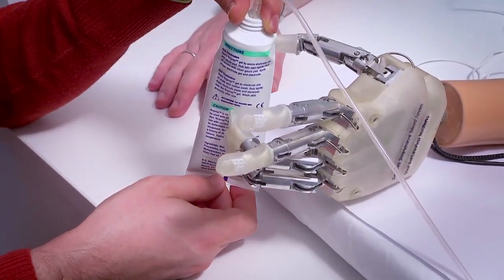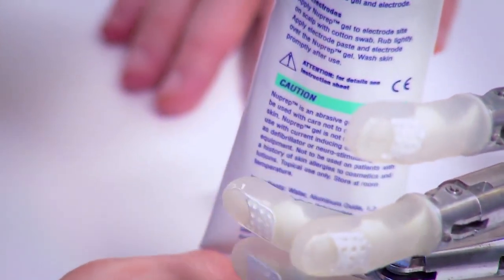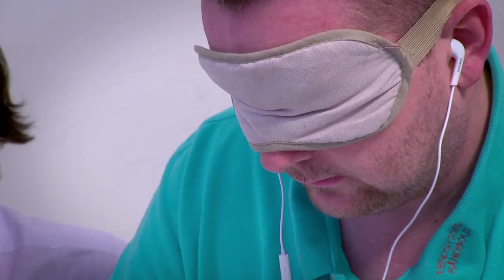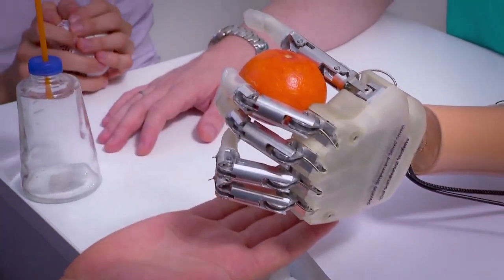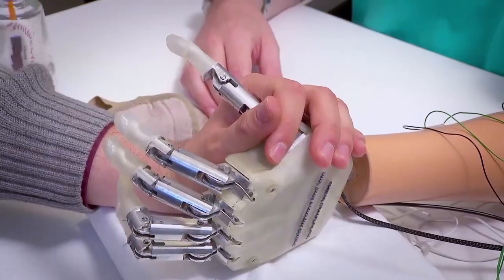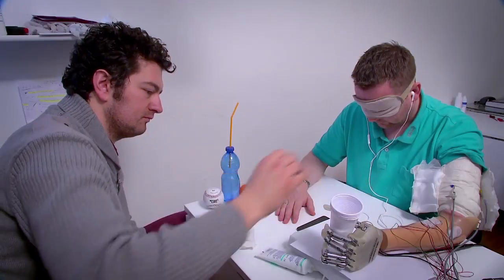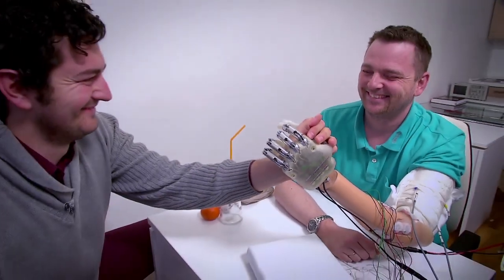Amazingly Dennis was feeling sensations from an artificial hand. They put this round object in the live hand and I squeezed around it and I could immediately tell that it was round. After ten years where you haven't had any kind of sensation of form then suddenly you are able to actually feel again in your lost hand, that was really incredible and something I will never forget in my life. It was really a special moment.